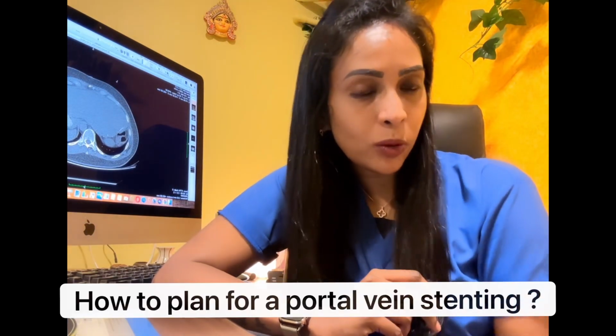Here is a short video explaining about the planning for a procedure. Most of the times we think procedure is all about the technique, going in and doing the procedure. But we will realize that planning plays an important role. So please watch this video to understand how to plan for portal vein stenting.